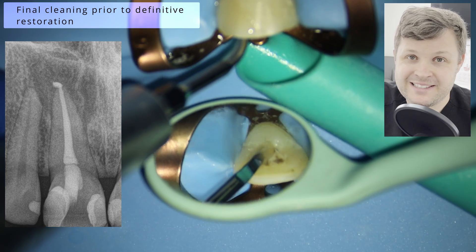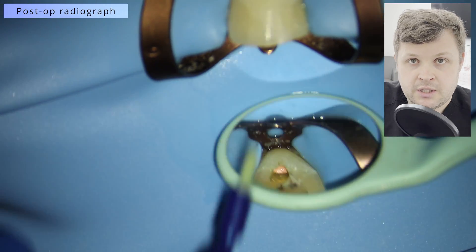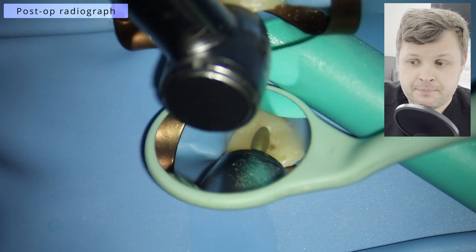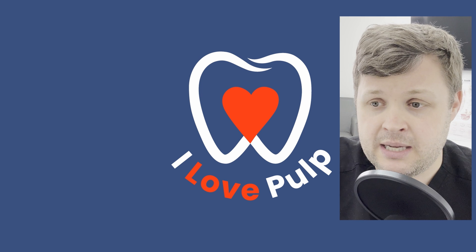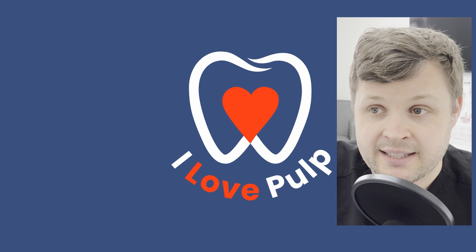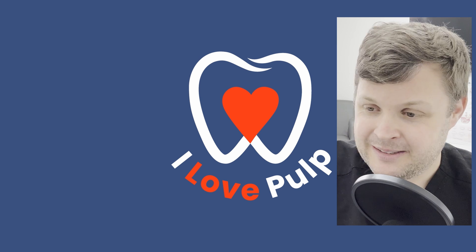We take a final x-ray and it looks really nice. There is a little bit of extrusion — there's a huge debate in endodontics about sealer puffs and extruding bioceramic sealers. Bioceramic sealer is very biocompatible, but it's important to note: bioceramic sealers don't always resorb when extruded — that's a really important distinction. On balance, what I like to do is confine the sealer to the root canal, but if a little bit squirts out at the end, I'm not going to lose too much sleep over it.